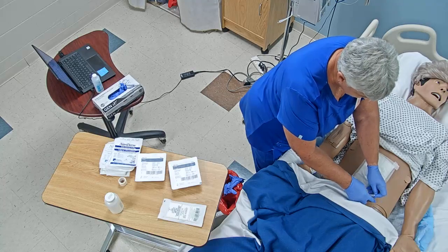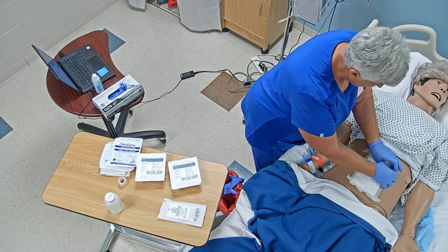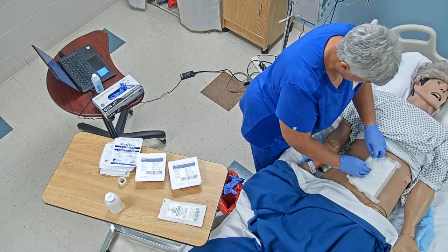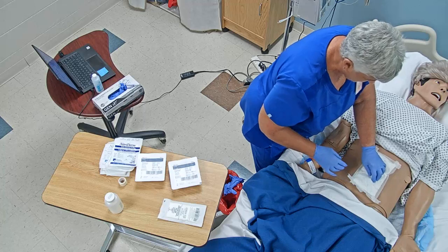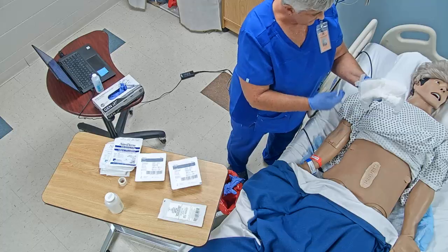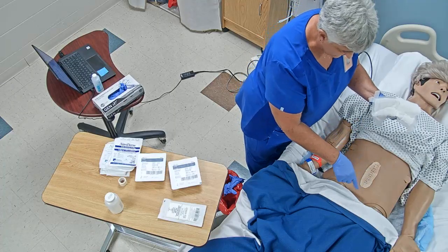Sometimes we can use adhesive remover, which helps loosen that tape if we need to. Sometimes just an alcohol pad rubbing on there will help loosen that if you're not having any problems with dry skin and alcohol. So once we've loosened that all up, we want to grab that and pull it straight up. And I'm going to be evaluating to make sure we don't have any tape problems as that's coming up, the medical tape tearing the skin or anything.